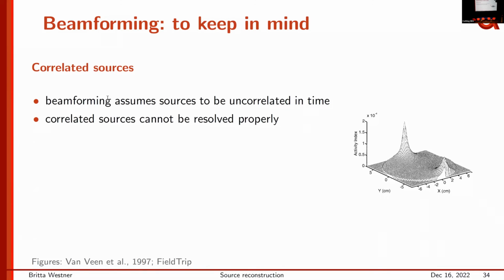Okay, thank you. And another question is about using individual head shapes. So using individual head shapes versus using just a sphere shape is to care about these variations in curvature and so on in the head. But then when you do co-registration, well, we use these fiducials, but still it's kind of a bit ad hoc, the co-registration. So I just wonder whether we actually get a lot, whether we can leverage this caring about these individual variations if we have problems with co-registration. Maybe we can just use sphere shape all the time.